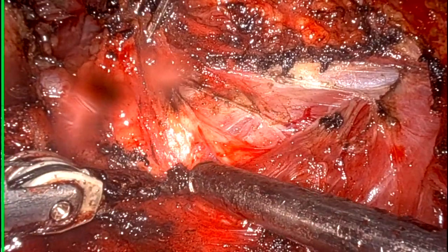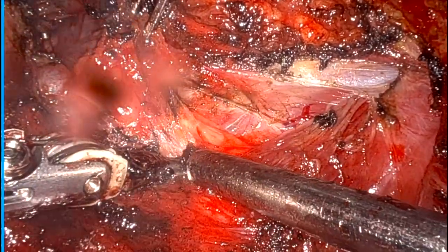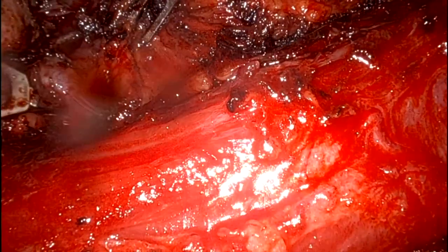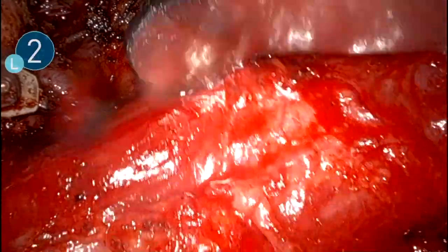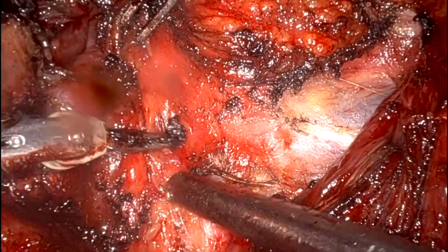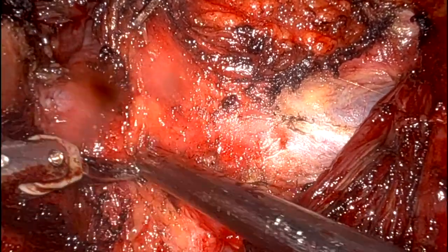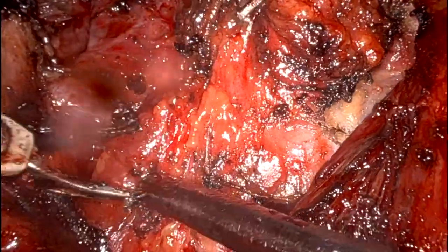Now I am moving up and soon we will get the spinal accessory nerve. You can see my camera is not clean. But I am okay with it because I am not working over that spot. My working field is clear. Now I am looking for a spinal accessory nerve.